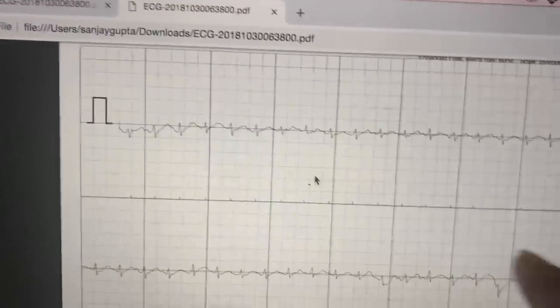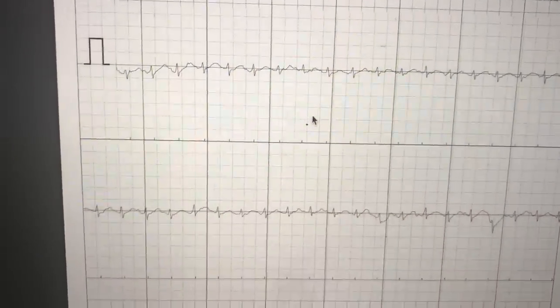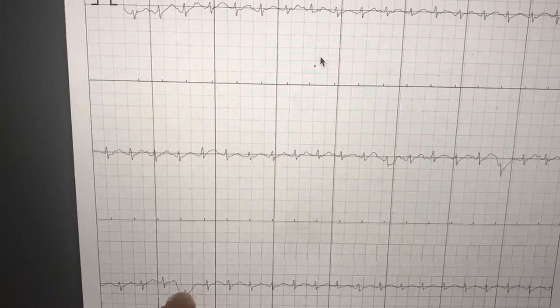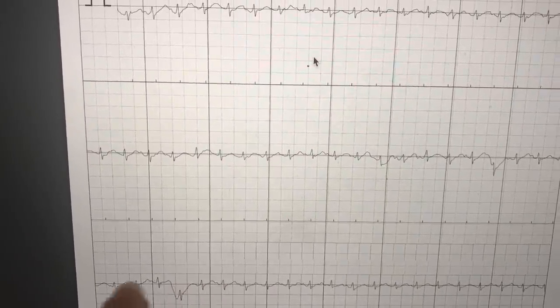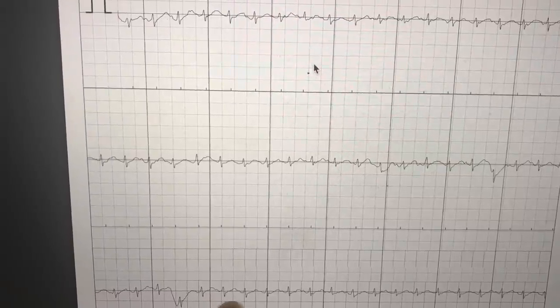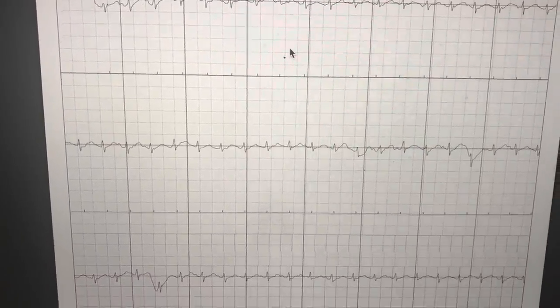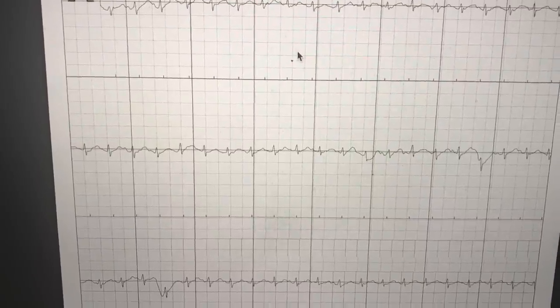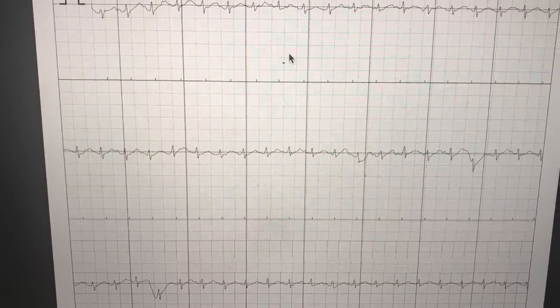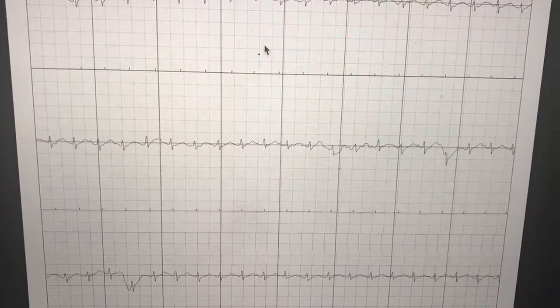A lot of people get worried about variations in the baseline — I would ignore all that, that's just artifact. The only thing you want to know is the distance between the two spikes. If the distance between the spikes is the same throughout, it is not atrial fibrillation. In atrial fibrillation, every single distance will be different. I hope this helps — take care, all the best.